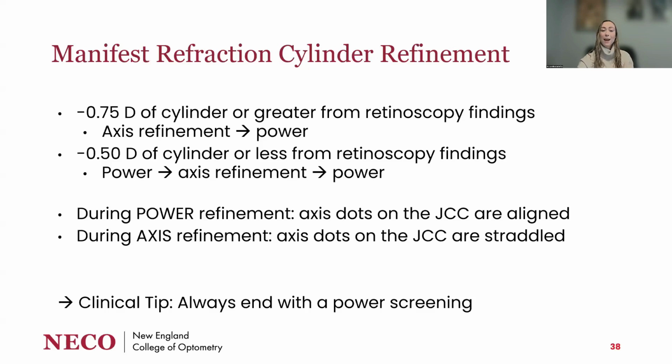During power refinement, the axis dots on your JCC are aligned. During our axis refinement, you have to twist the knob so that the axis dots on the JCC are straddled. And my clinical tip here is to always end with a power screening.